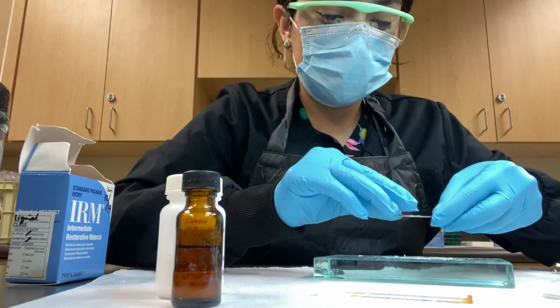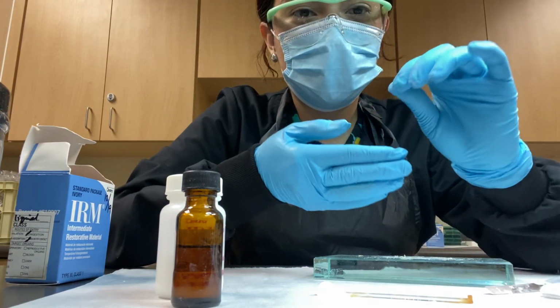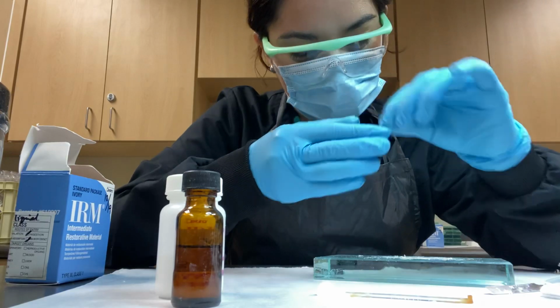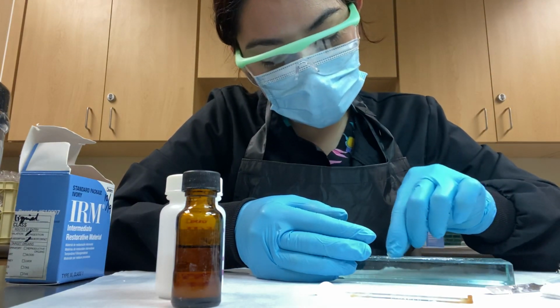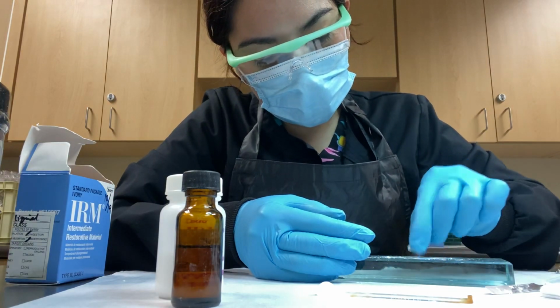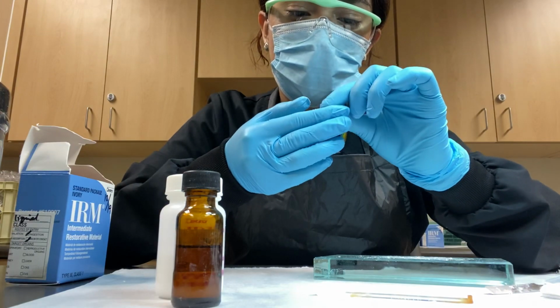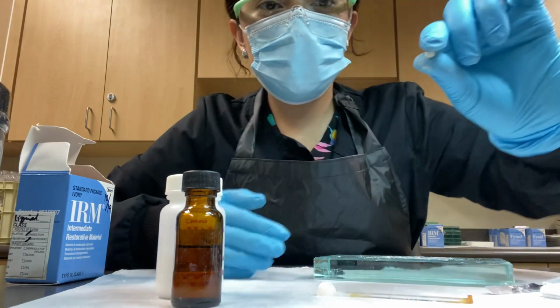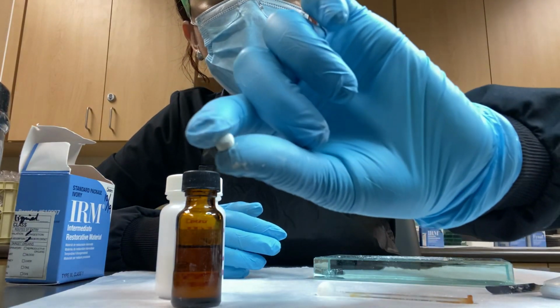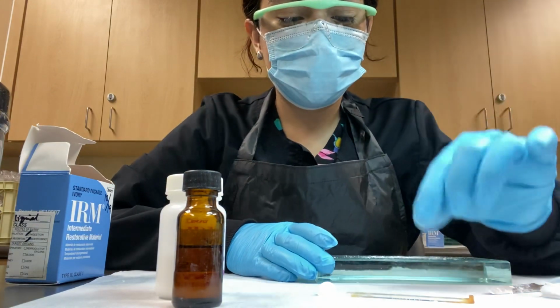Okay, my mixing time is done. And now I get this and prepare it into a little ball. I'm just grabbing any excess powder that I might have not incorporated. Then it should look like this. And then later on it will harden.